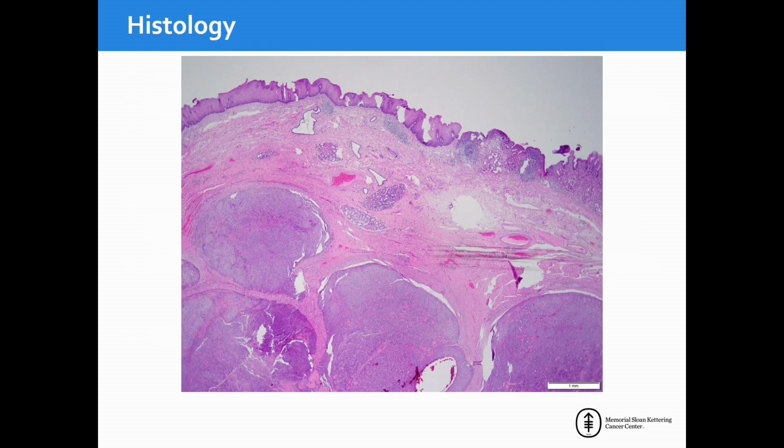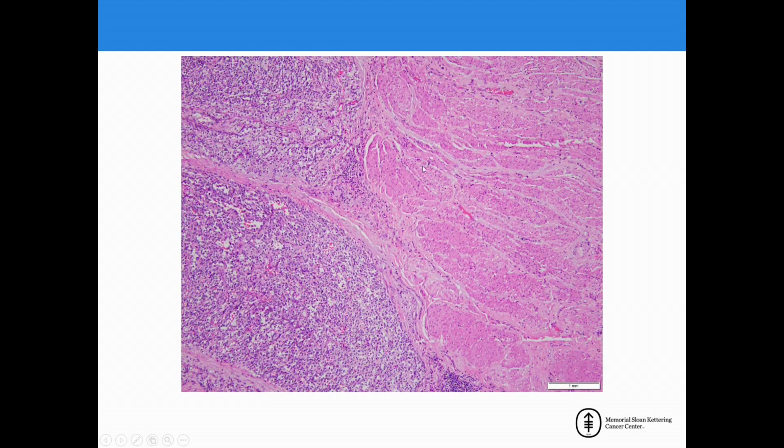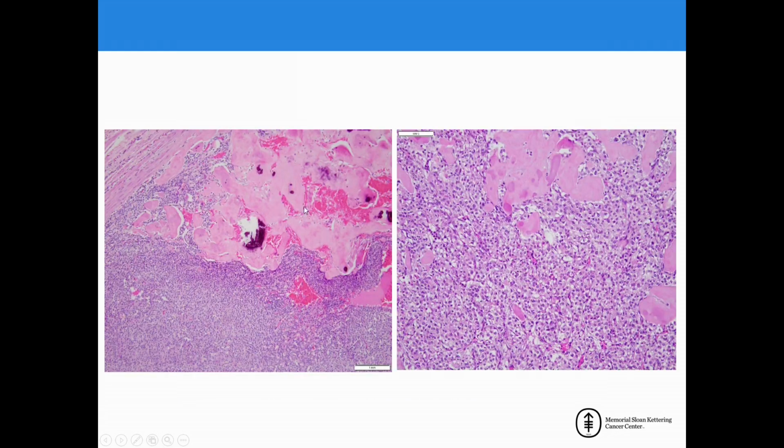So here's the GE junction tumor, as we see here. The tumor is mainly located in the wall here, the GE junction wall, a lobulated tumor. In focal areas, it ulcerates the mucosa. Otherwise, it mostly involves the wall. Here's the muscularis propria, and it also goes down to the serosal aspect. As we can see, it's a very lobular tumor. Some areas had this very glassy pink, almost osteoid-like material at the periphery, focally in multifocal areas.